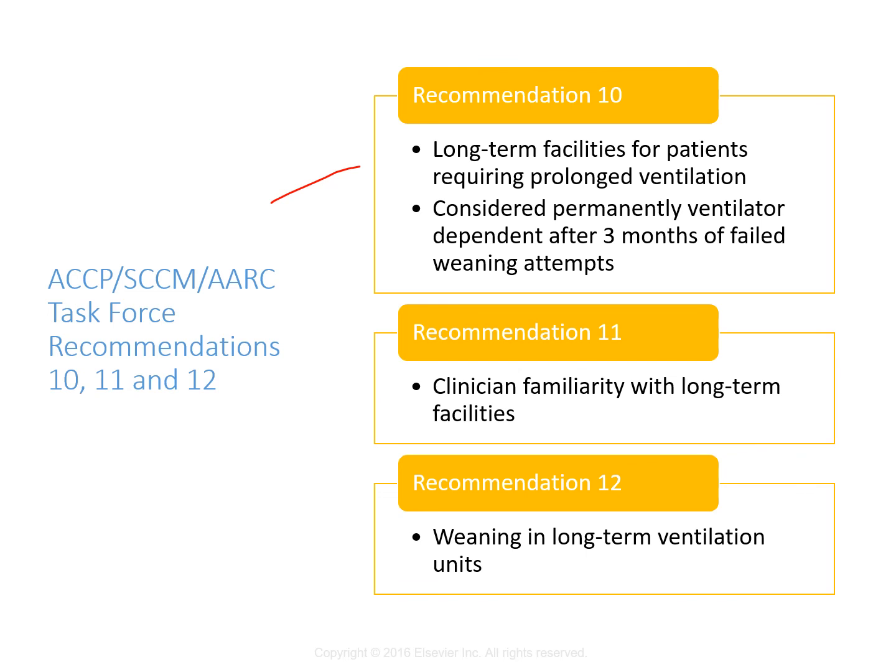So they're customized to that patient in that situation, and they can use a variety of techniques. Some patients may not need an artificial airway and just require noninvasive ventilation during the night. They usually wean at a slow pace for these long-term patients, so you'll see a difference if you go to one of these long-term places.